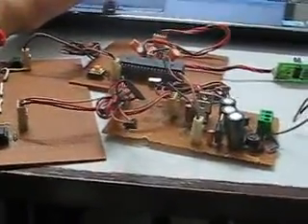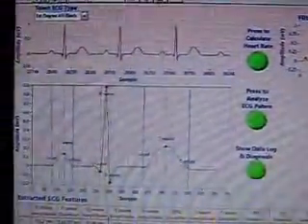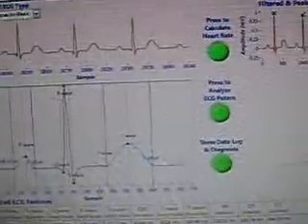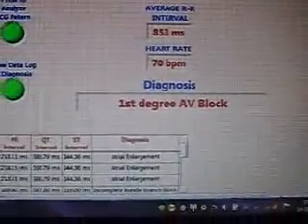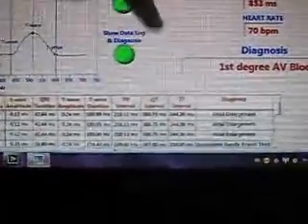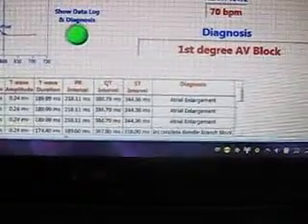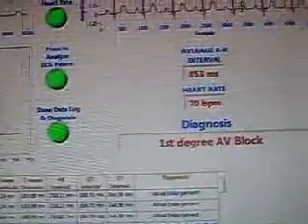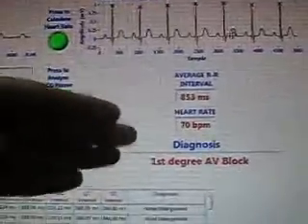Now, another main feature: after diagnosing the patient, we can have a view of our VI like this. This is the block diagram view. This is the P wave, P duration, Q wave, R wave, S wave, T wave duration, PR interval, QT interval, ST interval of the different patients, which we have recorded first and shown in this. We are comparing these values with the normal patients, and through this comparison we can show the different diagnoses of the patient.